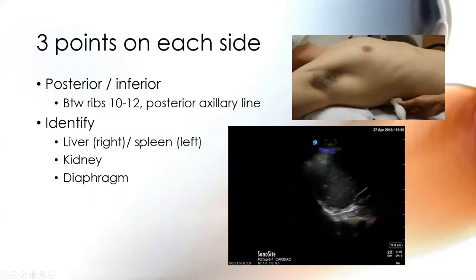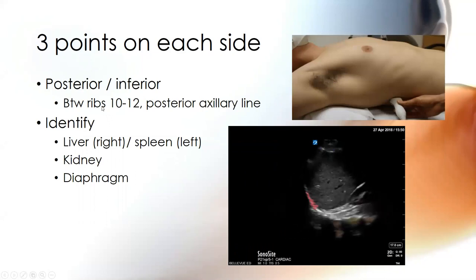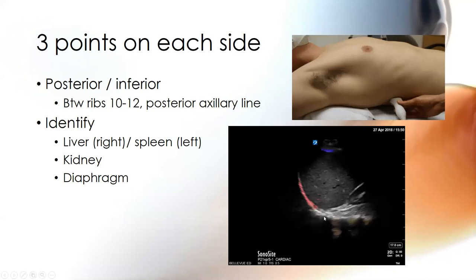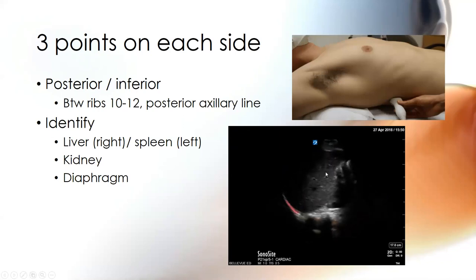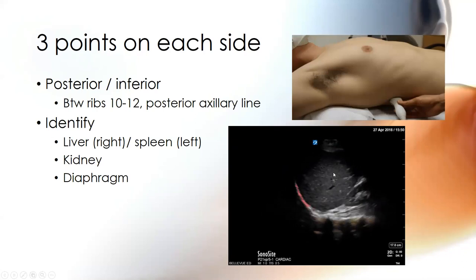And then your last area is going to be posterior inferior. This is the money shot for me. I really love this point, as some of y'all might know. You're going to look down here and say, that's not a lung. That is liver, right? So don't look here yet. What do I need to see? I need to see bat wing. You're like, I don't see bat wing. A line, lung slide.